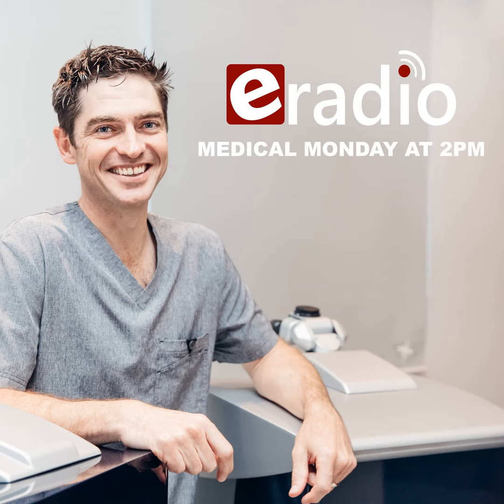And people think that when you're doing laser vision correction, you're actually burning. And that's why they appreciate what they describe as a little bit of a smell. So I tell all my patients that during or before laser, you're going to hear the machine make a buzzing noise and you're going to smell what you think is a burn. But it's not burning the tissue. It's actually a cool ultraviolet laser. So all it's doing is it's causing evaporation of tissue.